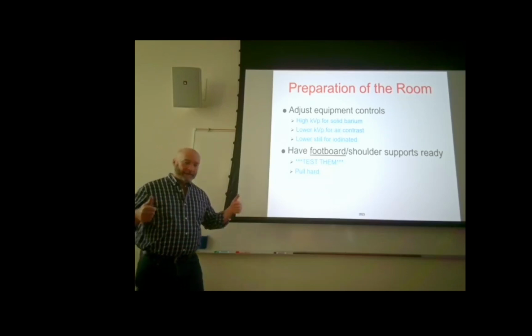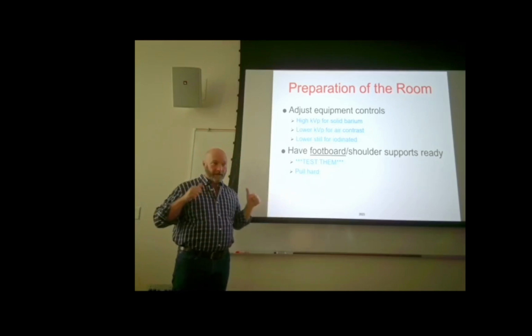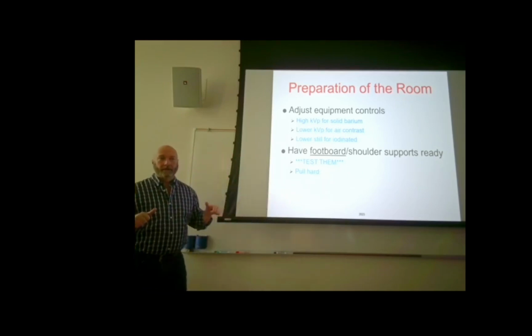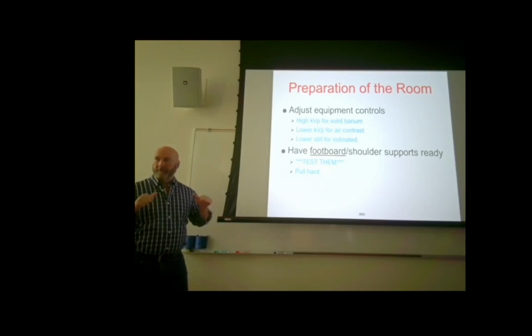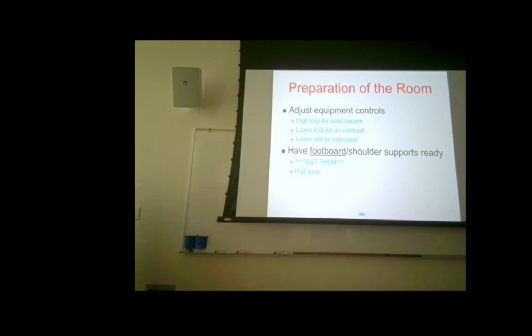So the point to this is you slide that on, and then you grab it, and you try to tear it off of the table, okay? And if you can't pull it off of the table with a good, hard jerk back and forth, it's there, right? And it's going to be fine. And then you stand the table up and get ready for the patient.